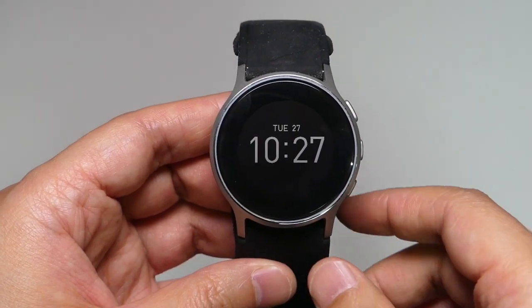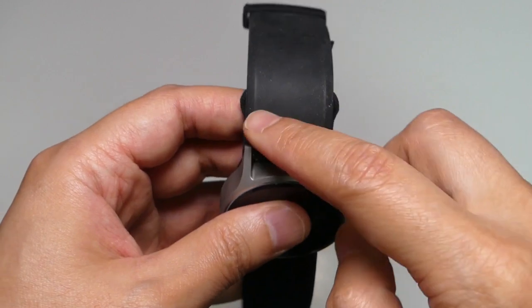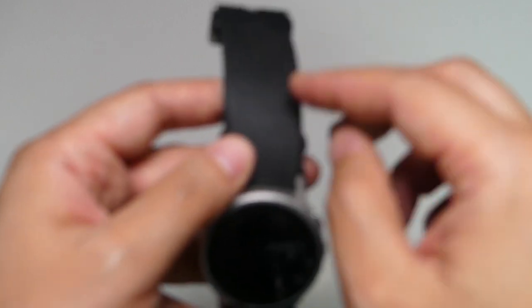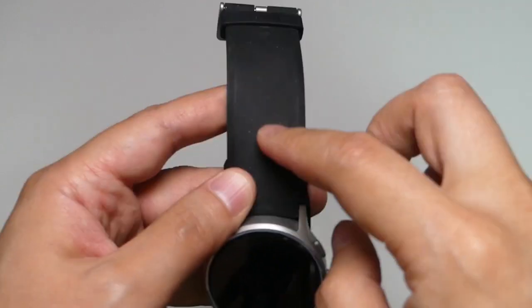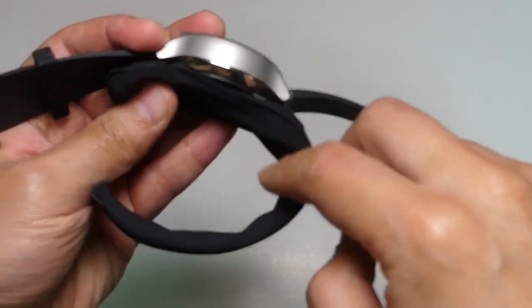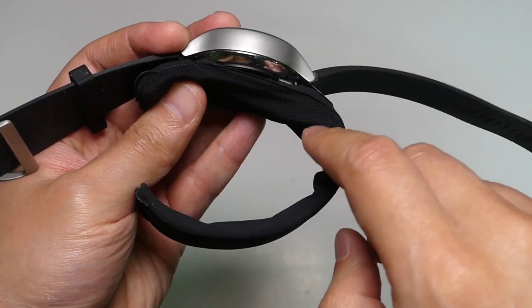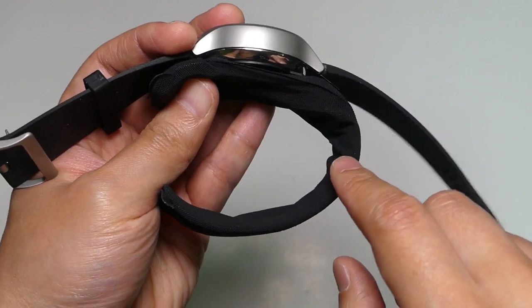Right now let's talk about some drawbacks of this smartwatch. First of all, the band, which is made of silicone — as you can see, it collects dust easily. This is the first drawback of this smartwatch. And the second, as you can see, this curve on the inside also collects dust easily. So you have to wash it once every couple of days.